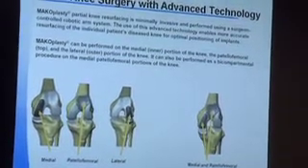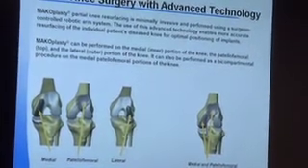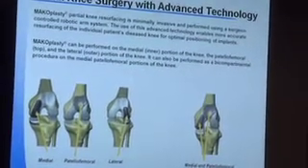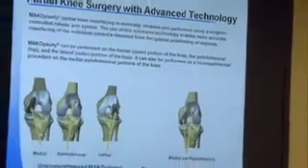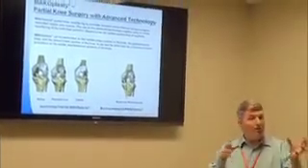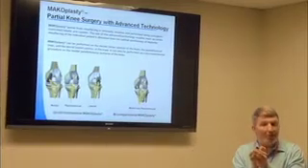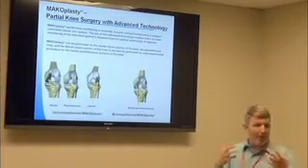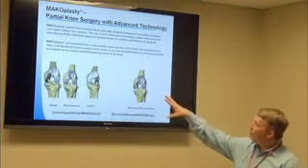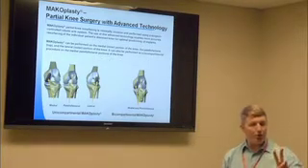It's using the surgeon-controlled robotic arm system. It enables more accurate resurfacing based on the individual's need. If I have a patient that's a candidate for this, I will send them for a special CT scan that we do here at the hospital. It gets plugged into the computer system that helps us run the robot, and we map that procedure based on your need. And so it's very patient specific. And the idea is that it can be performed on any of the different locations in the knee. We usually isolate it to 2 or less compartments.